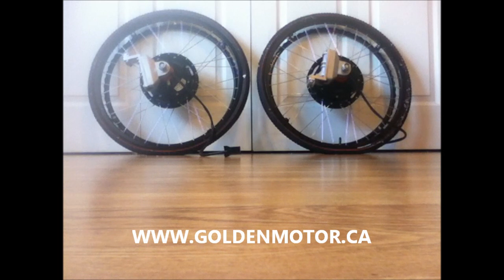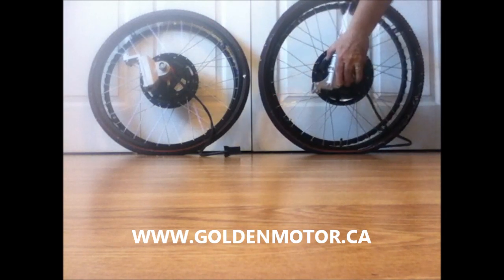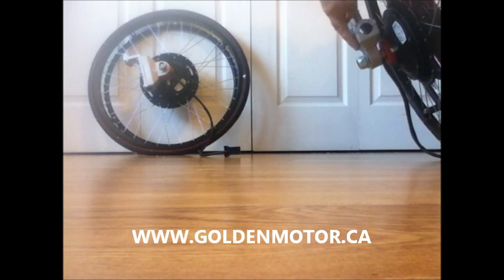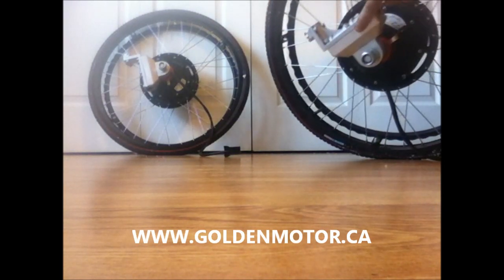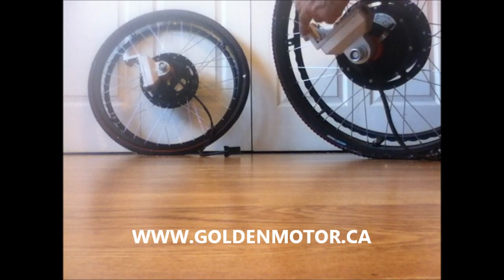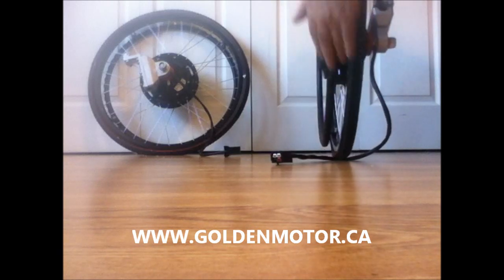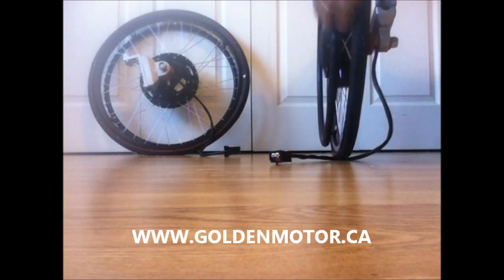Here we have two 24-inch Golden Motor wheelchair motors. They're quite impressive actually. This part here is for mounting onto your wheelchair — this part would go along the bottom bar, and this would go on the back, so they fit right in the back corner of your wheelchair. Very easy to mount. They have the normal handrail around the outside for your grip.